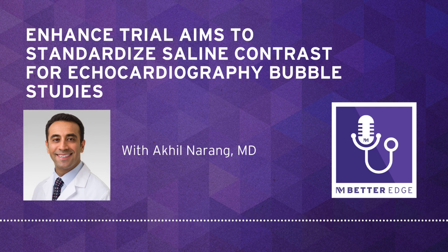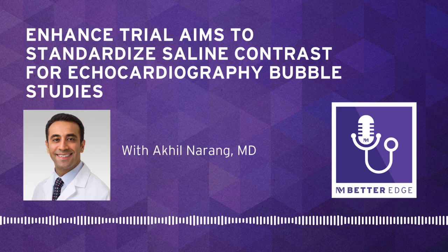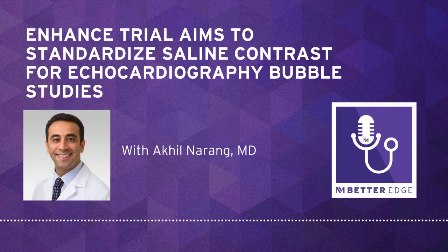So this is a prospective trial that uses an attachment to the saline syringe, and it uses a compound called polysorbate 80, which acts like a small surfactant that coats the bubbles and allows for more clear opacification of the right side of the heart and also uniformity in terms of the bubbles. And it also can be done with a single user as opposed to needing to have two users at the bedside. That's fascinating. That's just so interesting.